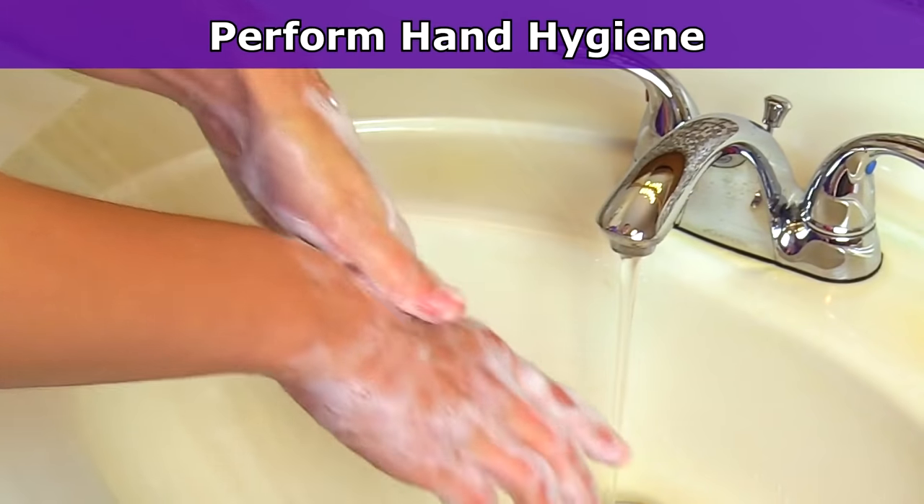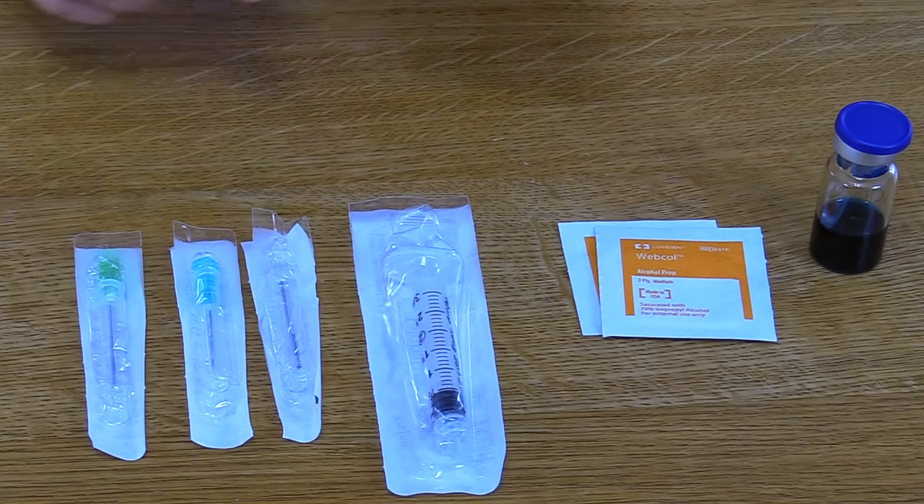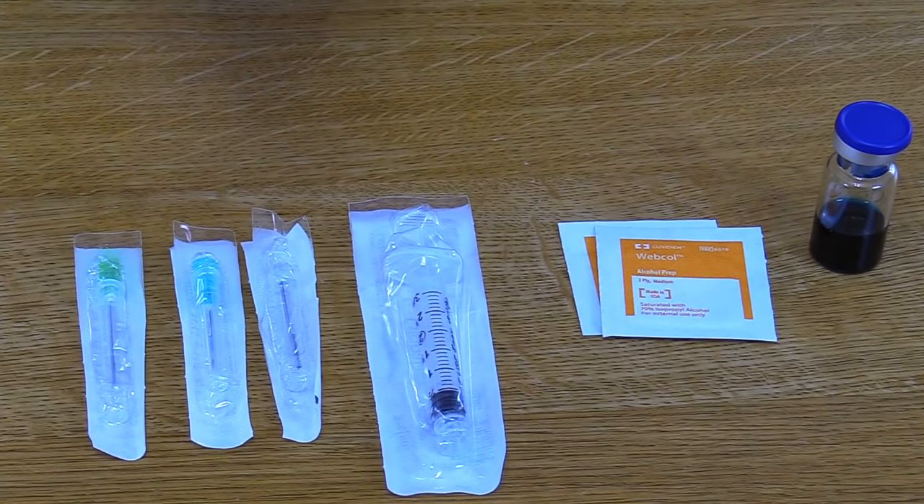Then you want to perform hand hygiene. After you've done that, you want to set up the syringe and attach the vial access device to the needle adapter if needed, because some may already be prepared.